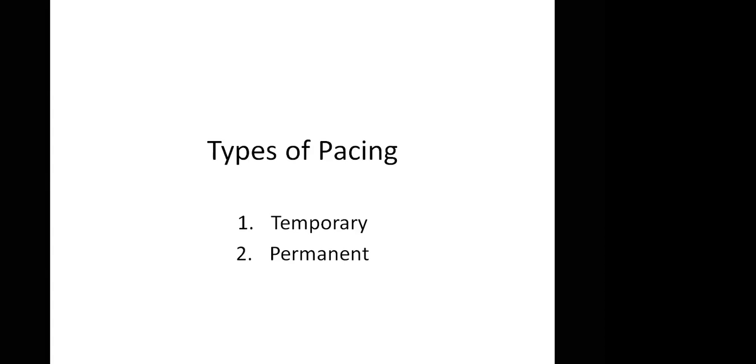So what I'm trying to emphasize is this. For this temporary pacemaker, we have the dual chamber and we have the single chamber. I want you to look at the one that has the screen. That's the first one that has the screen. You can see 80-10, right? Yes. Now, first things first, if you scroll it a little bit down, you see dual chamber generator written on it.